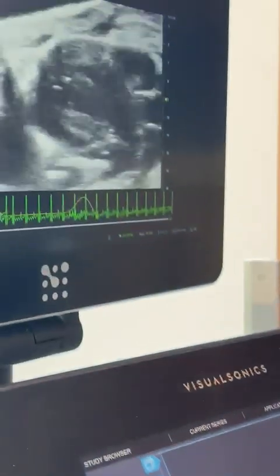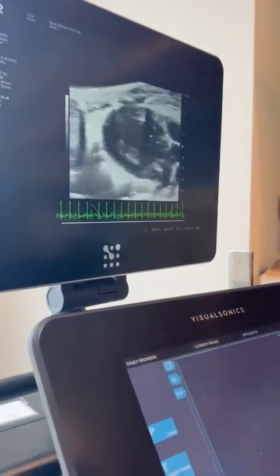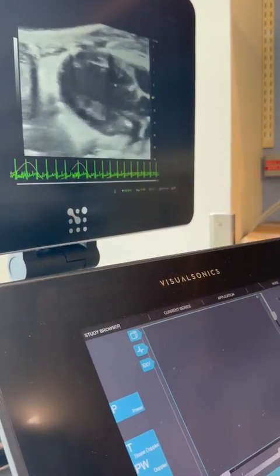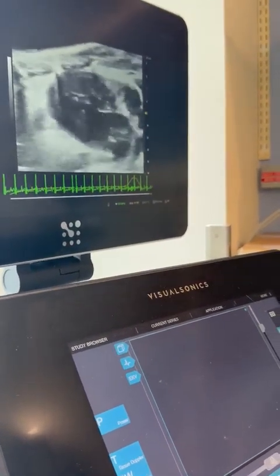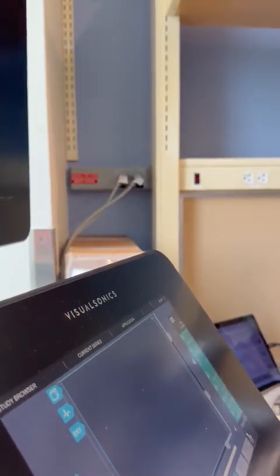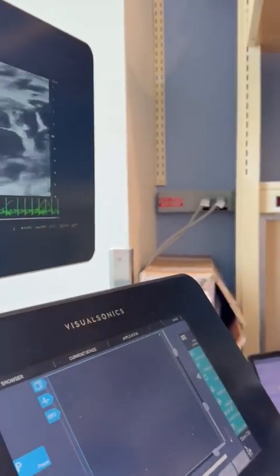So now we're just going to turn your small knob and bring the heart to the middle of the screen. Where the echo machine will be, right? It's not where it was. It was in the room over there. Turn the knob down to like. Okay, good. And then let's turn the big knob a little bit, and you'll see it gets back into plane. 1.8.